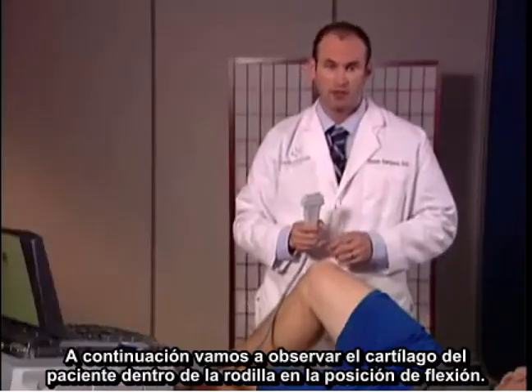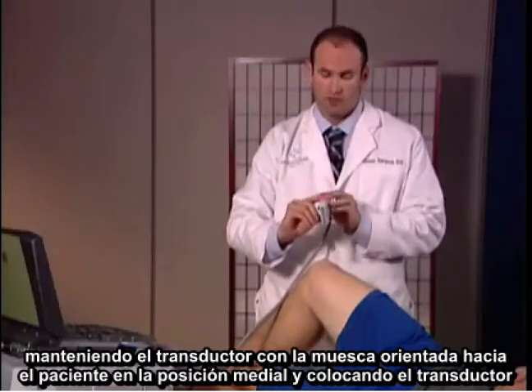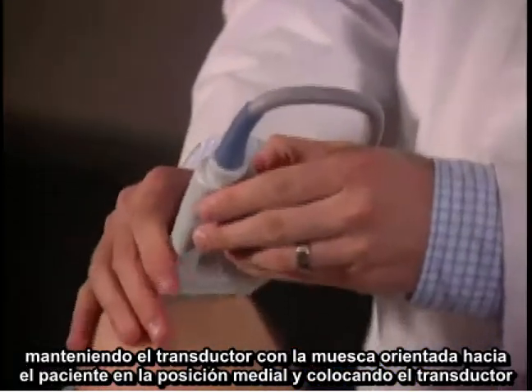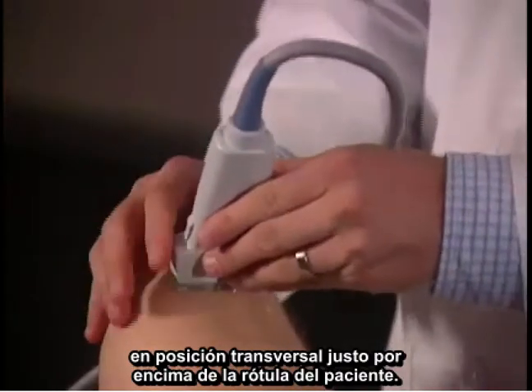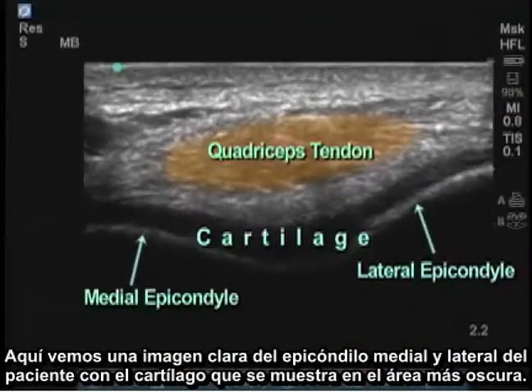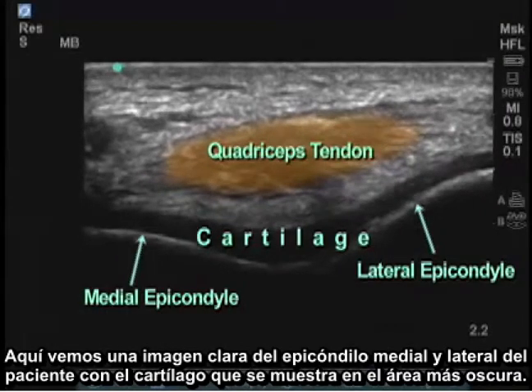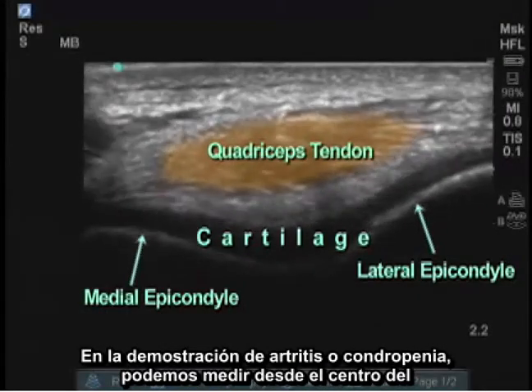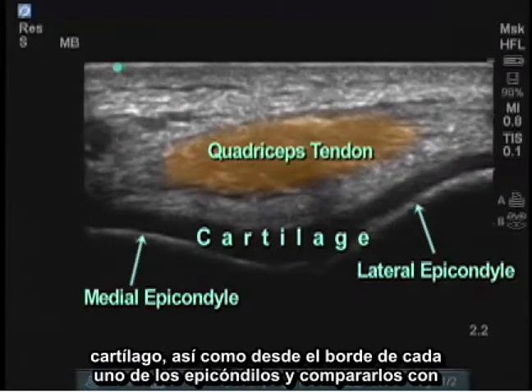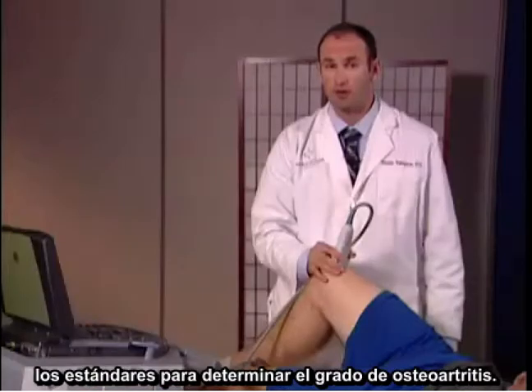Next, we're going to take a look at the patient's cartilage with the knee in the flexed position. By holding the transducer with the notch facing towards the patient in the medial position, I'm placing the probe in cross-section just above the patient's patella. Here I see a clear image of the patient's medial and lateral epicondyles with cartilage shown in the area of blackness. In demonstration of arthritis or chondropenia, we can measure from the center of the cartilage as well as at the edge of each epicondyle and compare them to standards to determine the grade of osteoarthritis.